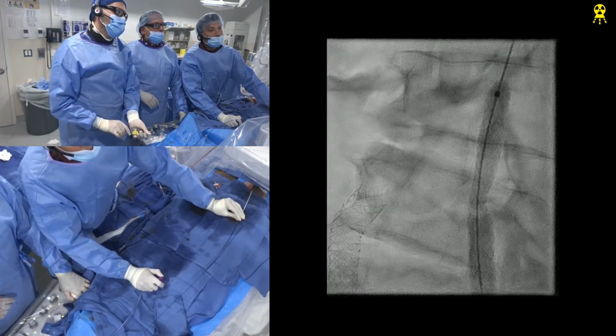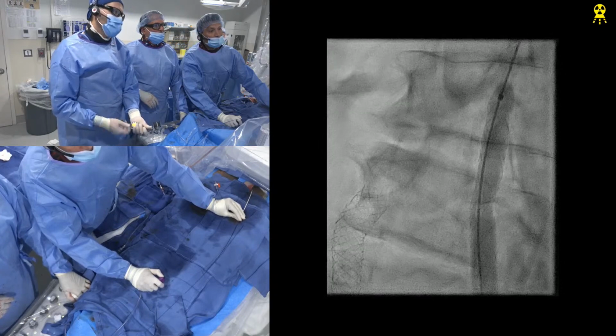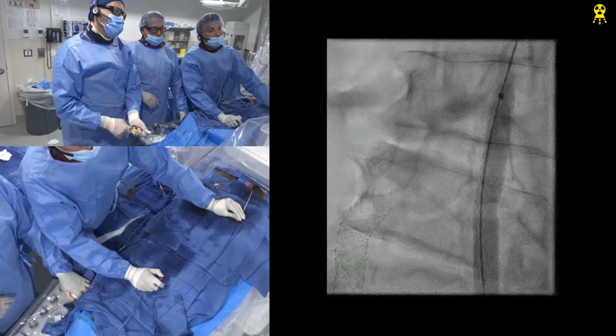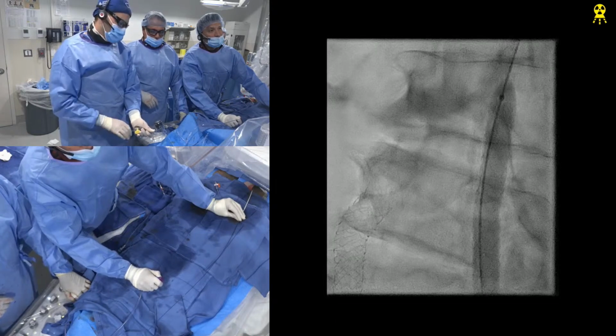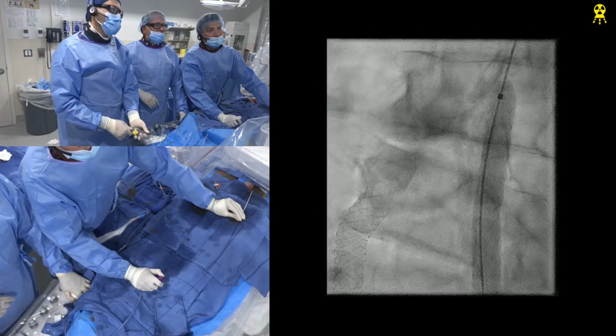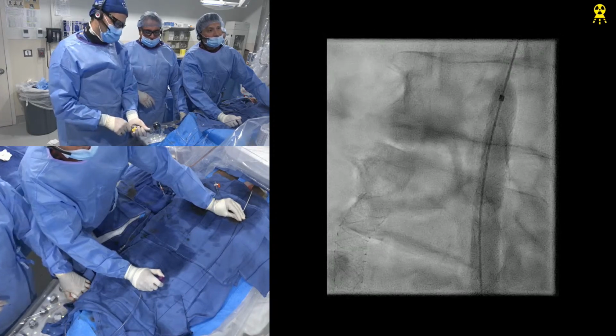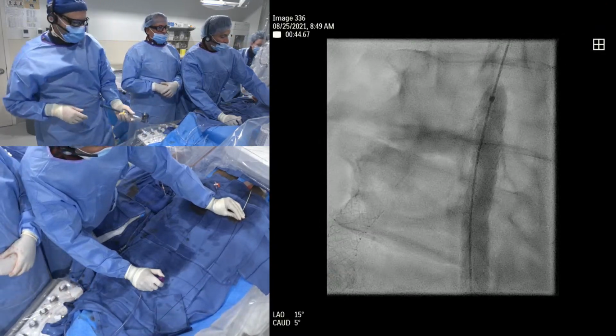Careful. Yeah. There's 8. 8, 9, 10, 11, 12. Okay, that's fine. I wouldn't give any more dye. No, I just seen. You've already taken your dump, so you can't do much. Okay, down. Okay.